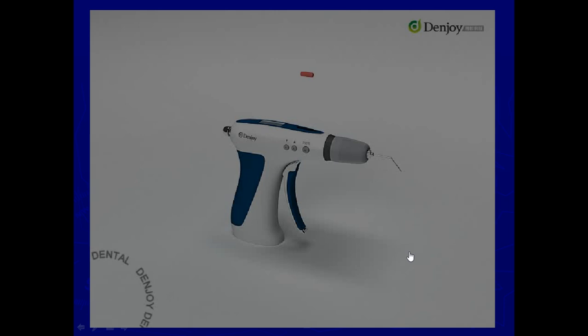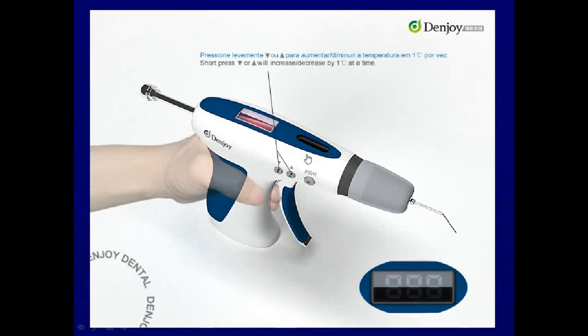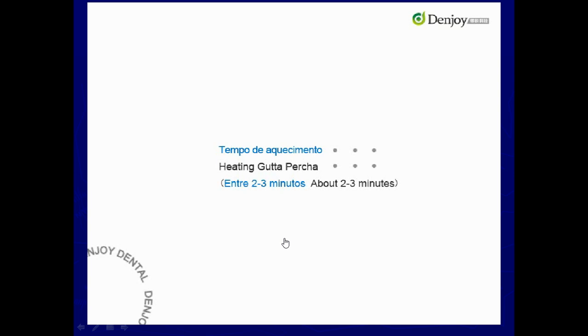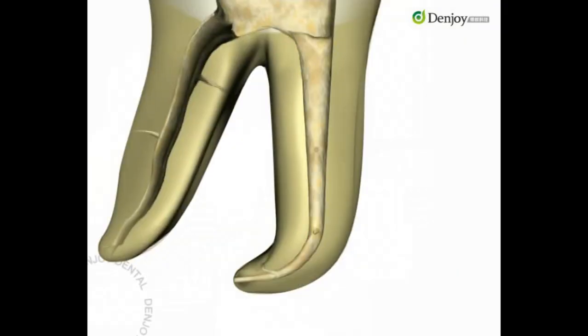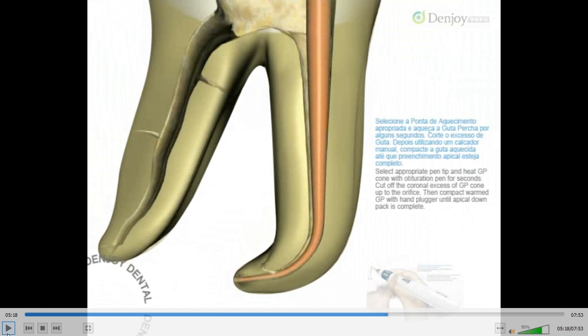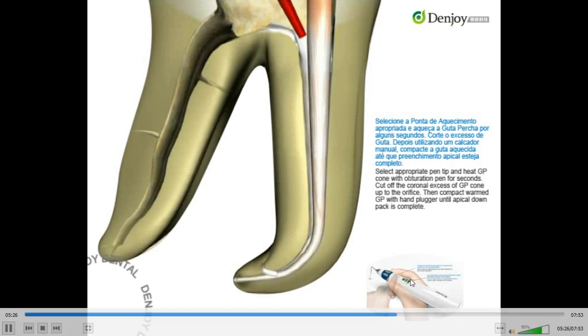So this is how the plunger is pulled back and the GP is placed here. This is the heating chamber and we adjust the temperature. After 2 to 3 minutes of heating — this is done at around 200 degrees. After the master cone is selected and the heating gun is ready, the obturation procedure is carried out.